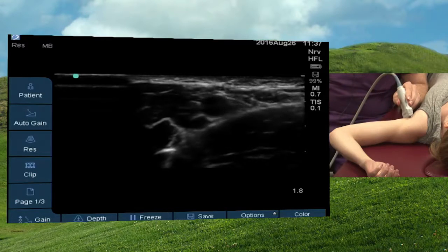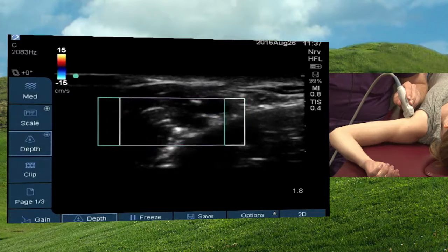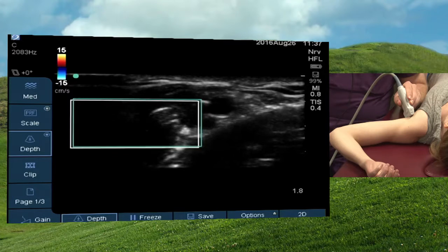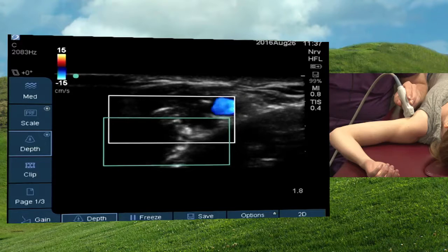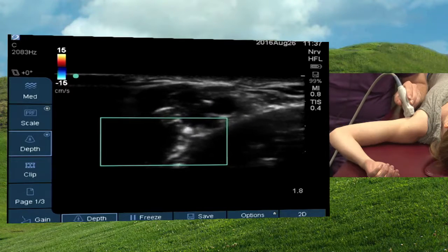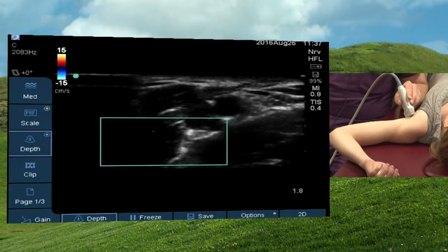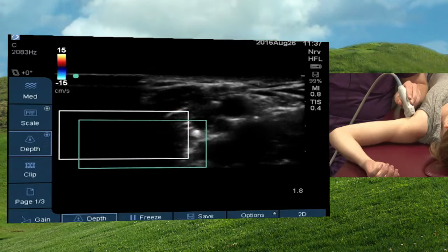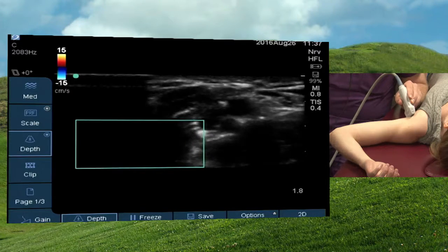And so what you would do actually on the Transarterial Technique, I'll point these out. So again, using the top right corner of my box here, that's a nerve, that's a nerve, and that's a nerve. So these 3 nerves, you have the radial, ulnar, and median nerves. Yeah, and musculocutaneous nerve right there, right? Dr. Schrandt is. Oh, okay. I can't get it. So it's kind of just right below there.